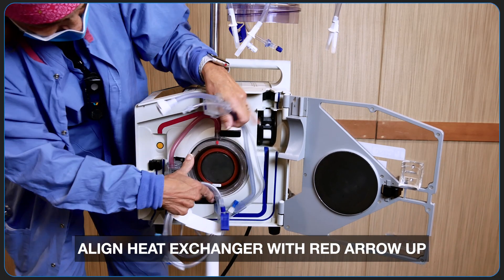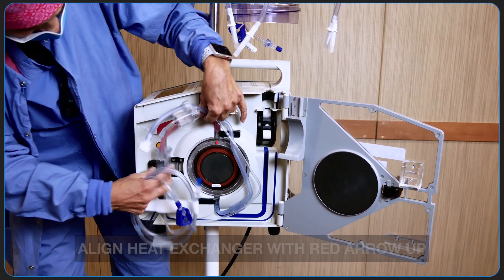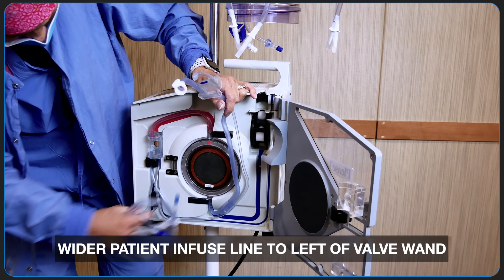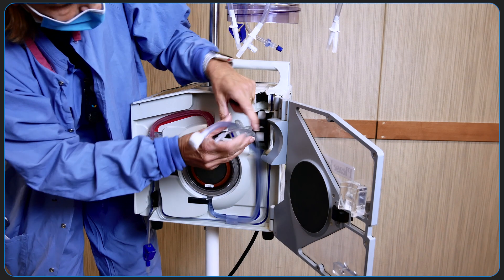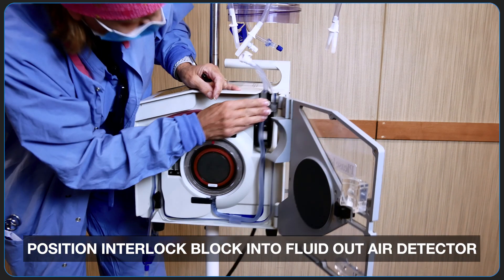The first step to installing the set is to align the heat exchanger with the red arrow pointing up. The pressure chamber is then firmly but carefully inserted. The wider patient infuse line is to the left of the valve wand, and the thinner recirculate line is to the right. Finally, the interlock block is positioned into the fluid out air detector.